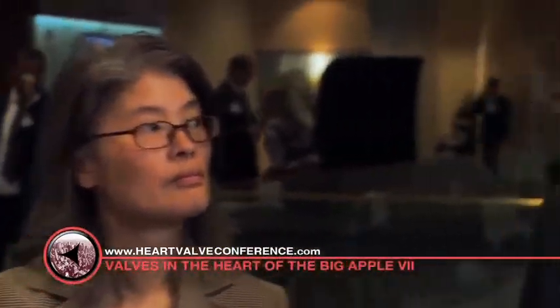And that's a nice feature for quantitation that 3D can help, because it can guide you to a standardized measure. It's interesting. It depends on the skills of the operators, right? If you have great radiologists or imagers that are very good and understand the cardiac anatomy, because many times radiologists do not, but if they do, they can give you accurate data from the CT.